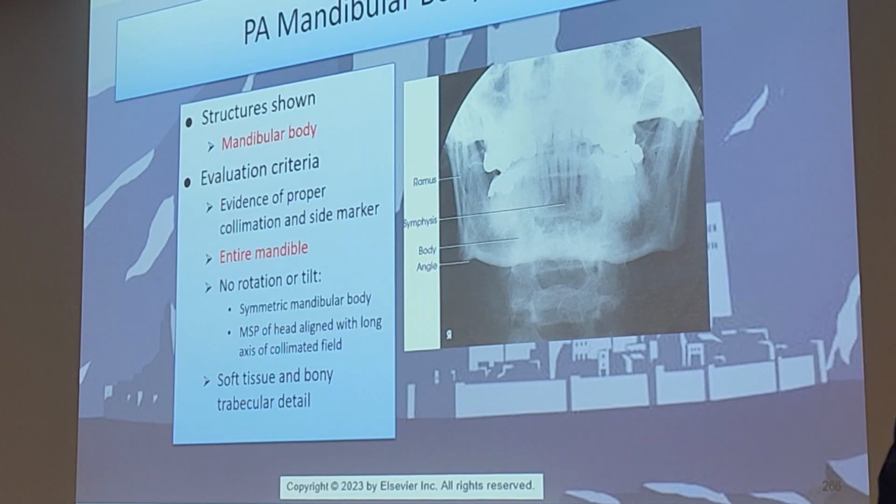You said it was because of the circle aperture, but if they had centered a little lower, would they have included it? Honestly, I think they're centered too low, period, on this. What did I say the centering point was? Higher, the lips. And where are the lips at? Up here. They're more on the mentum almost here. We shouldn't be seeing the C-spine. You should not be.